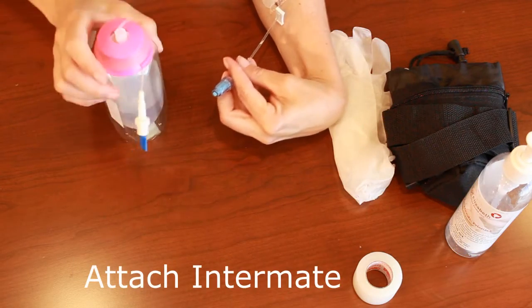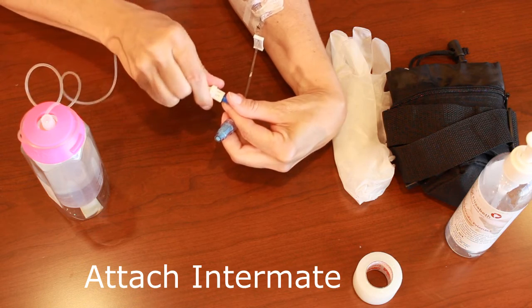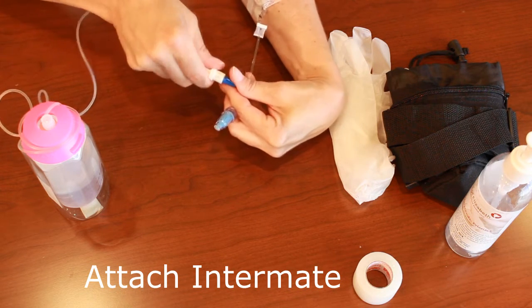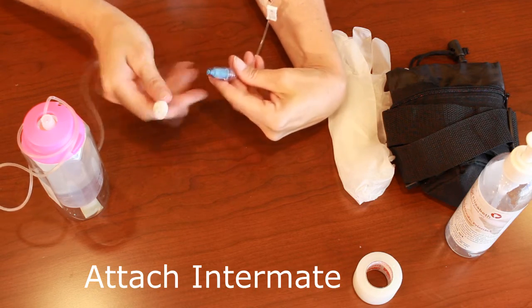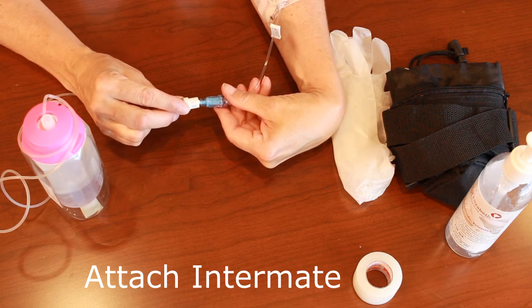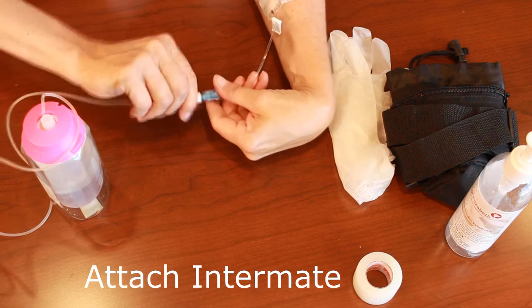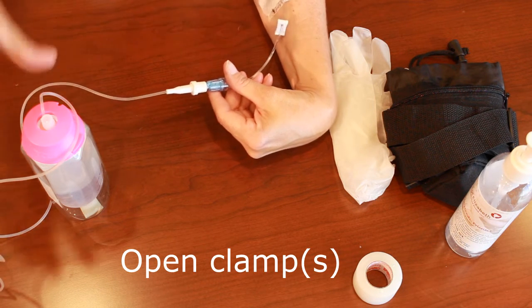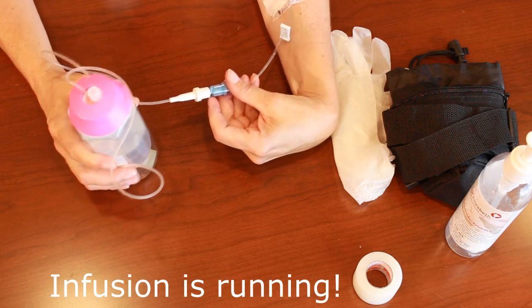We now need to attach the elastomeric infusion pump to our IV device. Uncoil the tubing and twist off the winged cap, ensuring the cleansed end is not touching anything, and do not touch the open end of the tubing. Attach the tubing of the elastomeric device to your vascular access device by pushing and twisting clockwise until it is firmly secured. Don't over-twist or it can crack the hub of your cap. Ensure that the clamps on your catheter are open, and if there's a clamp on the elastomeric tubing, make sure you open that clamp. The solution will now automatically start flowing — it's that easy.